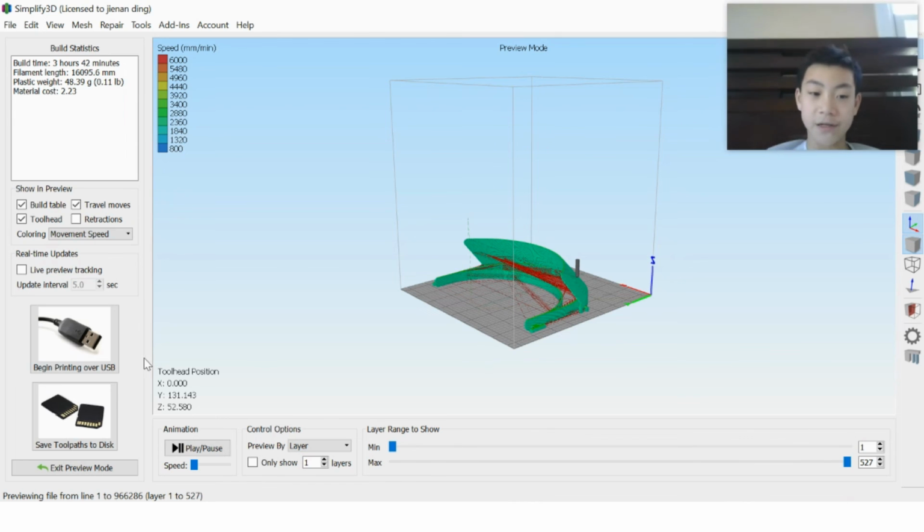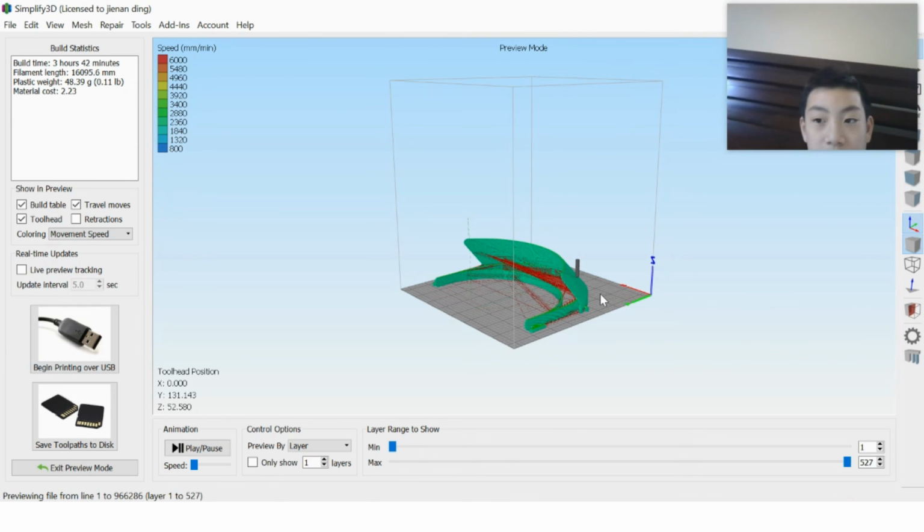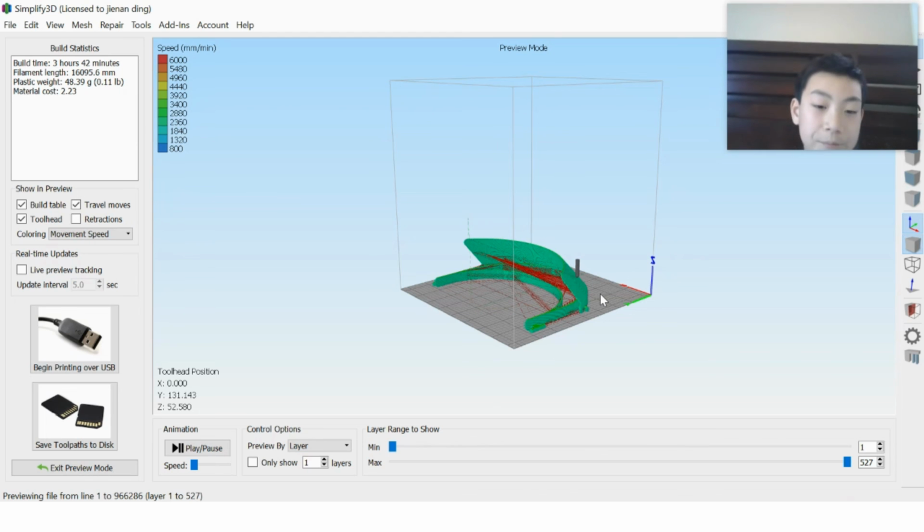If you want to actually see a difference, you can make each print get moved over a little more, but then you would have to change that in Notepad, so it wouldn't be as simple as just copy and pasting it. But right now, it's good, so I can save it in G-code and upload it to my disk, and you would print it. So that's how you do the automated printing. Thank you.